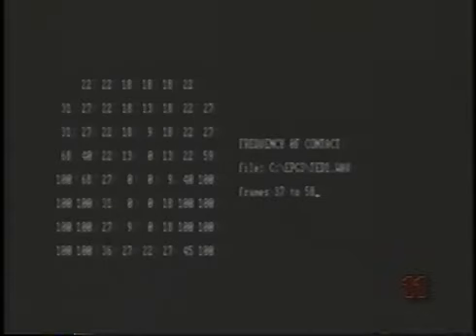This plot shows the frequency of contact of each electrode over a specified portion of the utterance. EPG is thus very suited for studying the sorts of connected speech processes that occur when we speak normally and spontaneously.